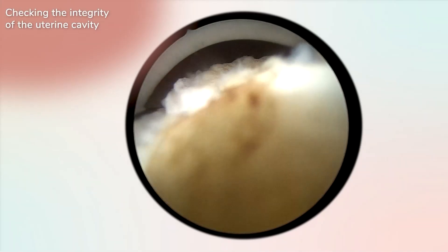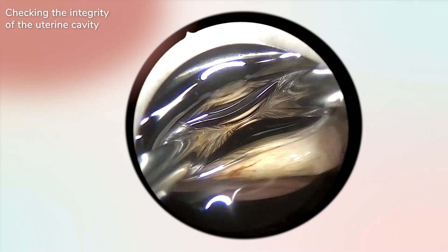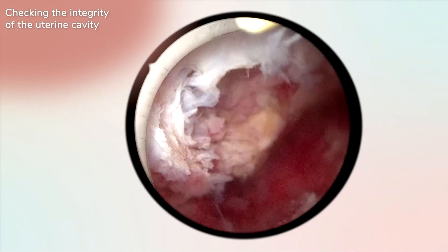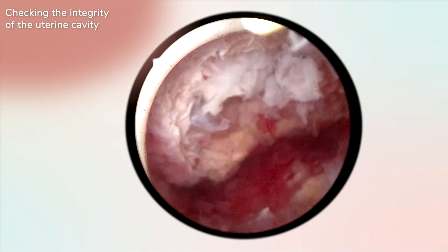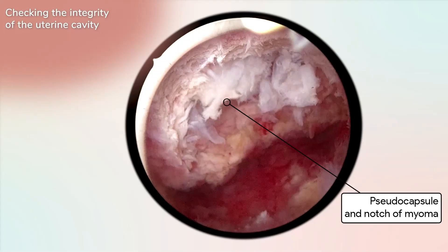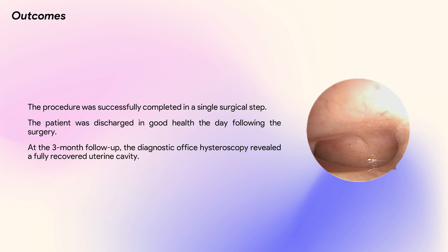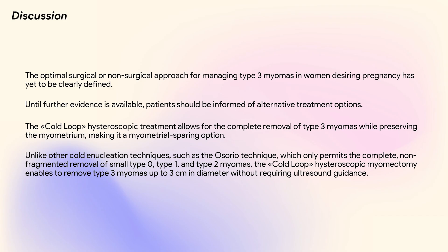At the conclusion of the procedure, the entire myoma has been successfully removed, allowing for a clear visualization of the myoma's notch along with its intact pseudo-capsule. The procedure was successfully completed in a single surgical step. The patient was discharged in good health the day following the surgery. At the three-month follow-up, the diagnostic office hysteroscopy revealed a fully recovered uterine cavity. The optimal surgical and non-surgical approach for managing type 3 myomas in women desiring pregnancy has yet to be clearly defined.